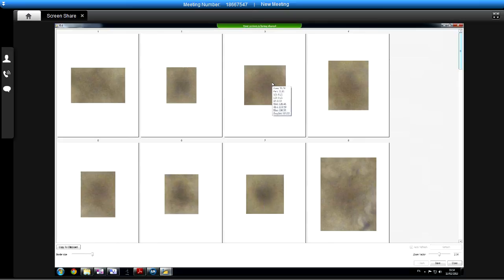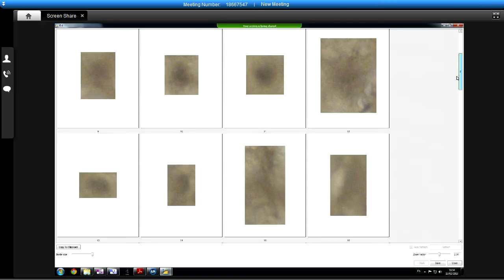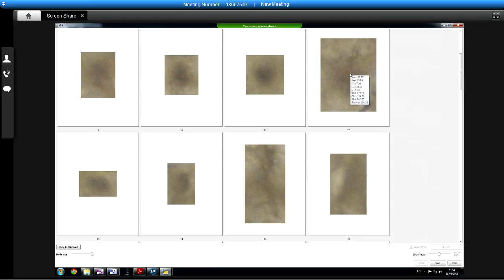So if you start looking at this, for instance, say you find some like that. It's not really positive, is it? I think so. So you can look at that and go, well, the area of that is 91, for instance. That one's 64. So you can look at these, and straight away you can start getting an idea in your head of, do I need to tweak that size parameter, for instance?